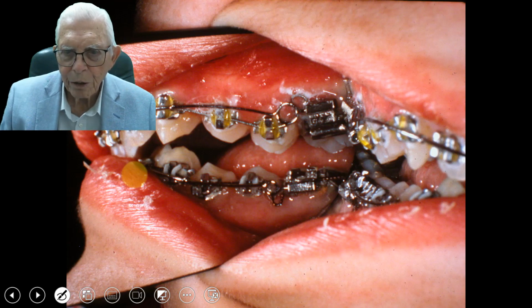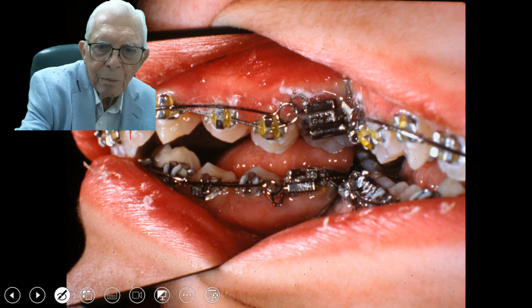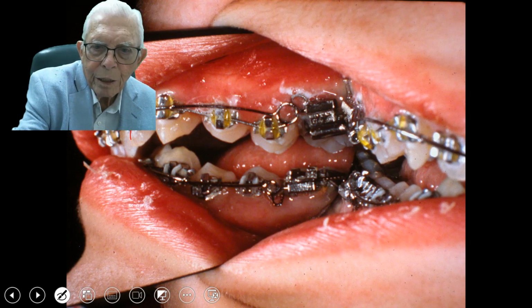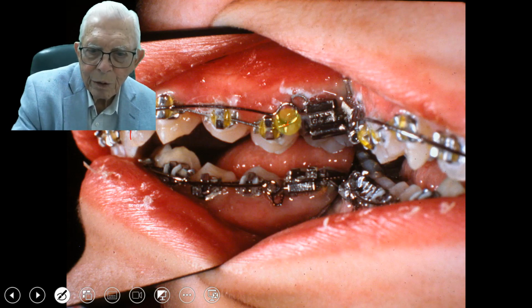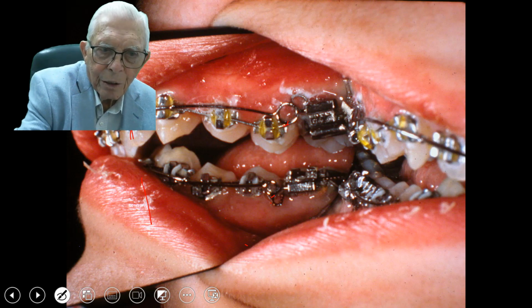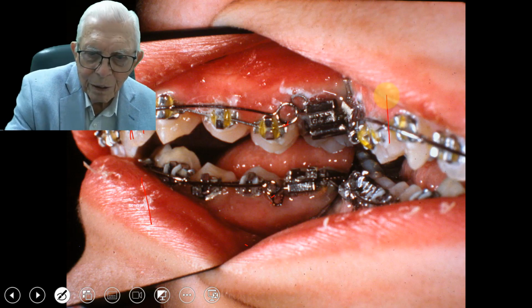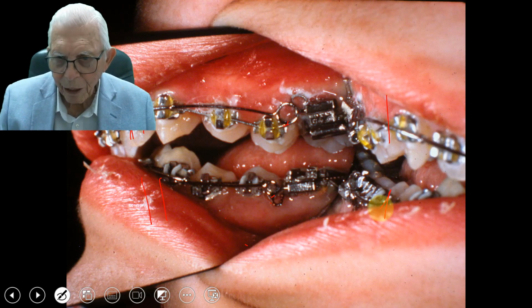And here are these intruding arches you see, and they're picking these teeth up. We pull that down, tightens that spring up, you see, and it's lifting it. We pull this up, it tightens this spring, and that brings these teeth down, and these up, these down, and these up, back here in the back. And closing that together.